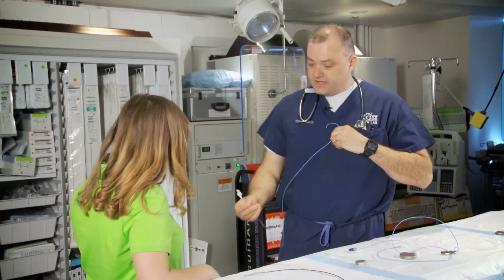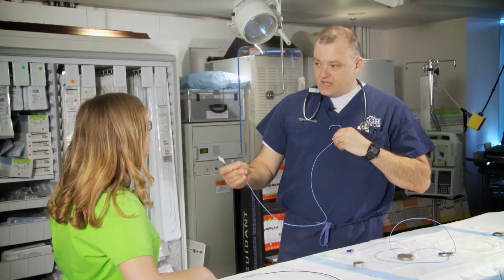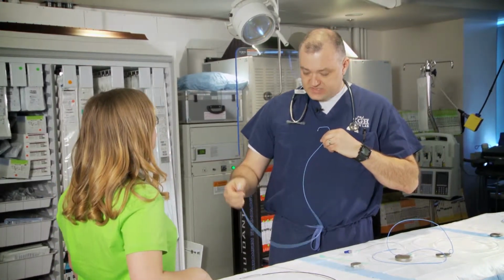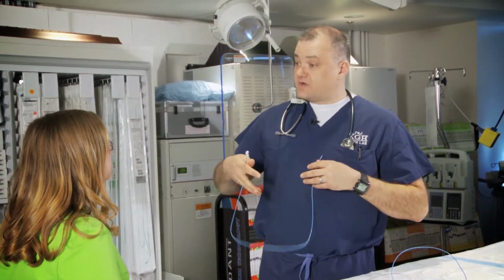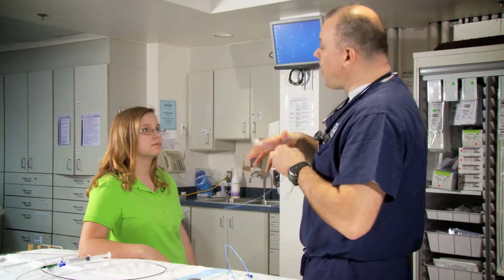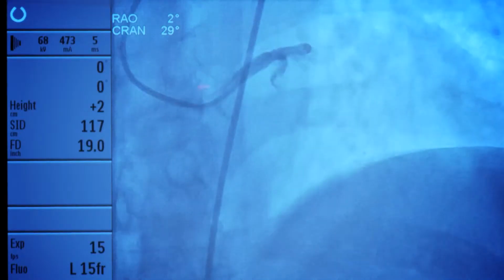We'll get this catheter up here, and this is hanging out at the end of your body, and then we hook this to the contrast. And then we have a special machine, we press a button and it ejects contrast out of here, and then it fills those arteries. We take a picture, and all of your arteries will show up like black tubes, just like a picture. And then we actually save it like a picture.